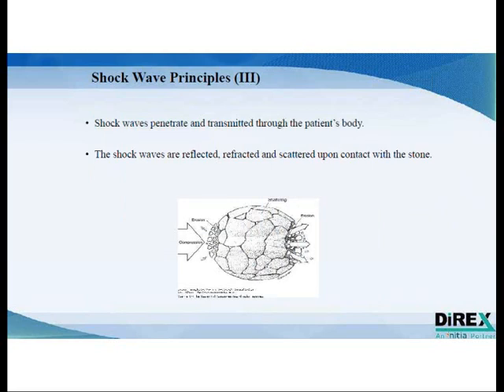The purpose of the shockwave is to travel through the patient's body until it encounters the stone. When it encounters the stone, there is a reaction with the stone itself. The shockwave will partially reflect off of the stone and partially refract into the stone, and gradually provoke fragmentation.